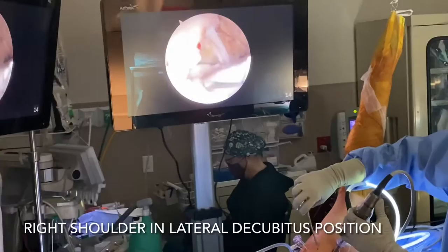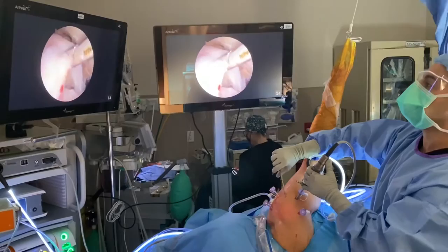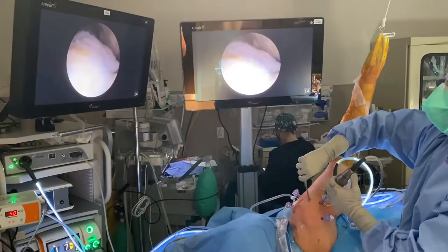We're here with an older patient that had a shoulder dislocation. What happens is you can get rotator cuff tears with dislocations in elderly populations. If you look here, we have a big hole right here where this rotator cuff is — it's torn right here. The goal of this operation is to take this tissue and repair it back down, so we're going to start to do that.